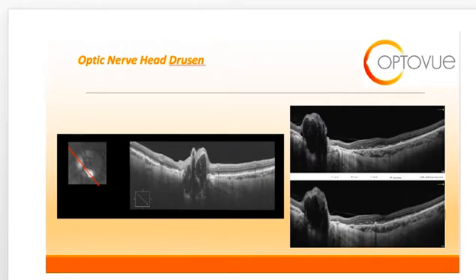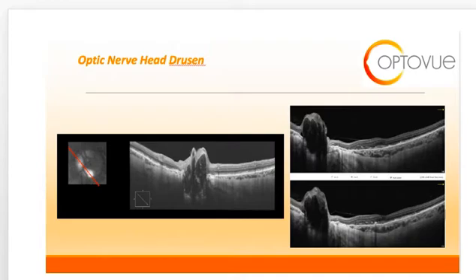Optic nerve head drusen is often mistaken for papilledema. However, it is a congenital abnormality. Optic nerve drusen are abnormal globular collections of protein and calcium which accumulate in the optic nerve. On OCT, optic nerve head drusen will appear as an elevated optic nerve head with a lumpy bumpy internal contour, which you can see here. It looks quite different in comparison to the slides on true papilledema. Optic disc drusen have also been referred to as congenitally elevated or anomalous discs.